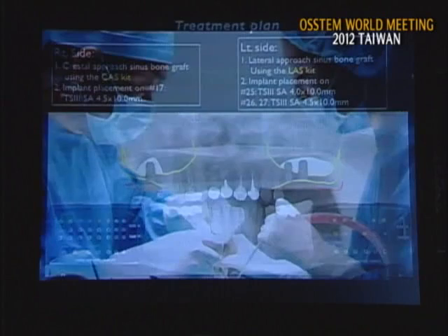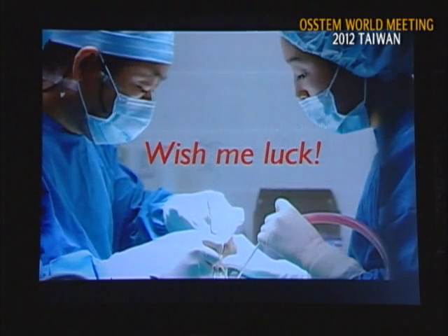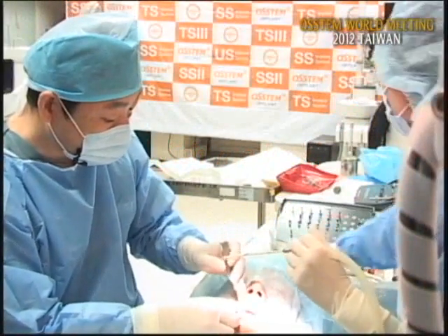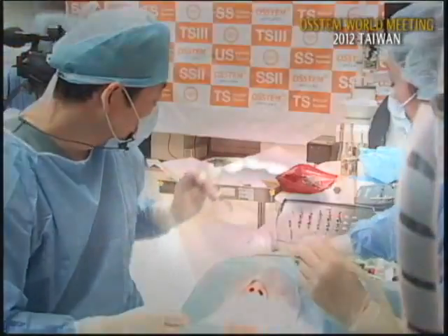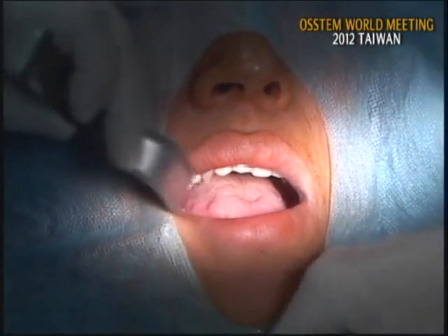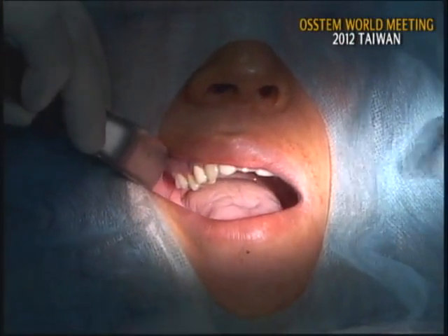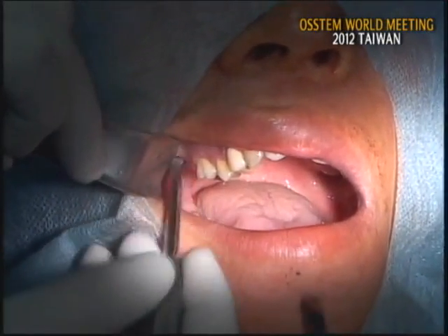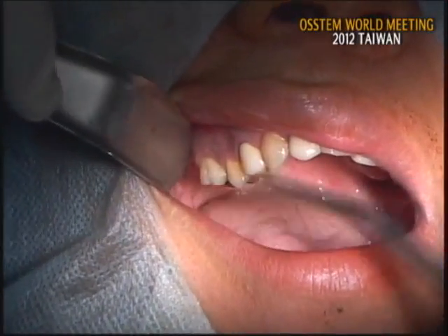Okay, wish me luck. I'll start right now. I finished the anesthesia already, and I want to start with the right side, the number 7 missing site. I'll use the CAS-KIT and try the crestal approach at this site. Okay, let's start.